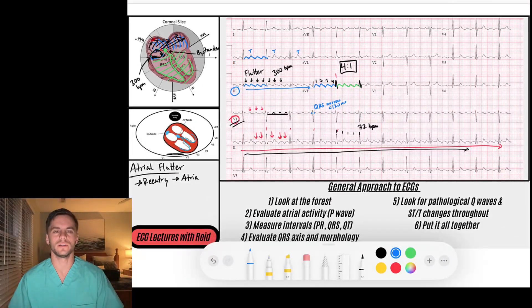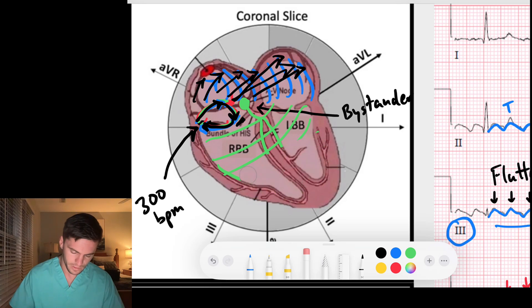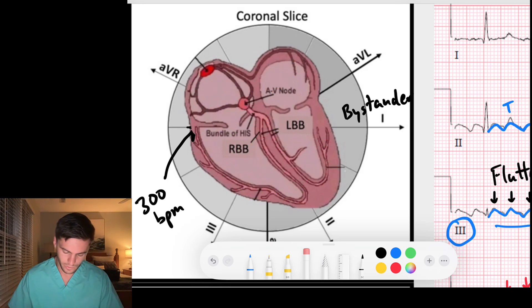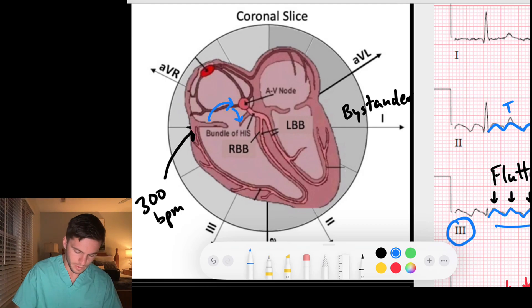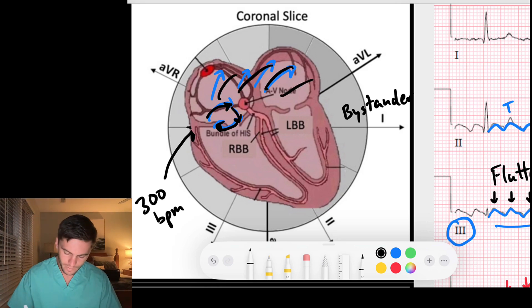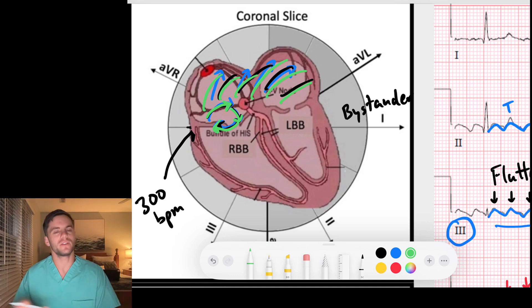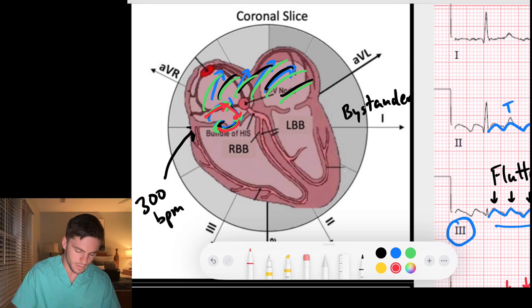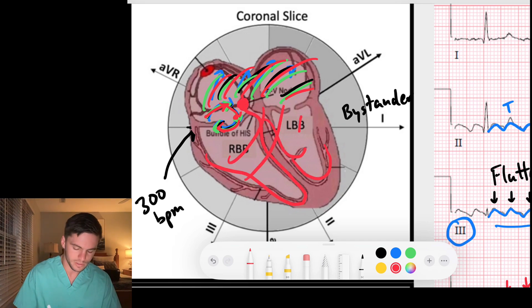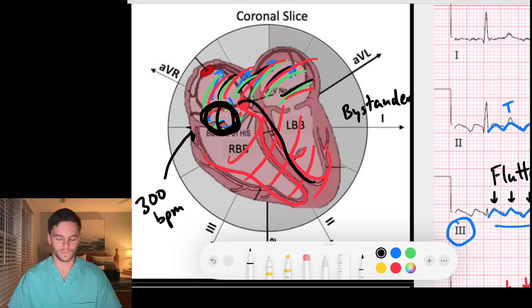This is atrial flutter with 4:1 conduction. That means the re-entry pathway goes around once — sends signal through the atria; around again — sends signal; around a third time — sends signal through the atria and AV node without being conducted. On the fourth pass, the AV node captures the signal and lets it go down to generate a QRS. Then the cycle repeats: one, two, three, four passes, then signal conducts. That is what 4:1 atrial flutter means.